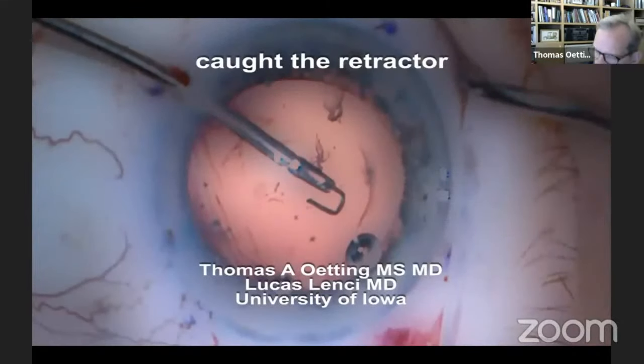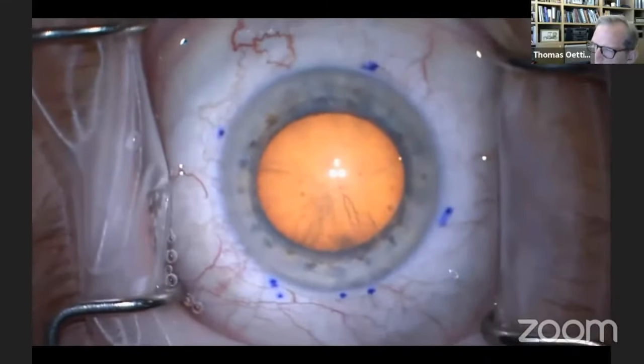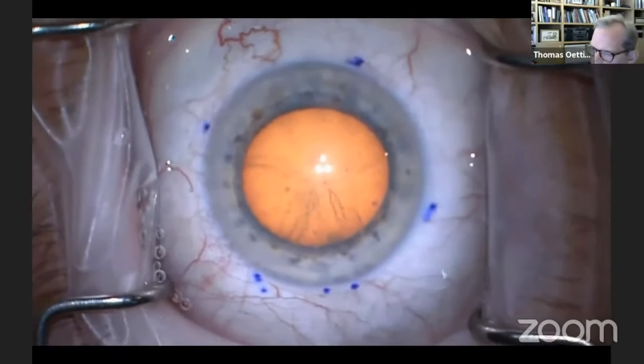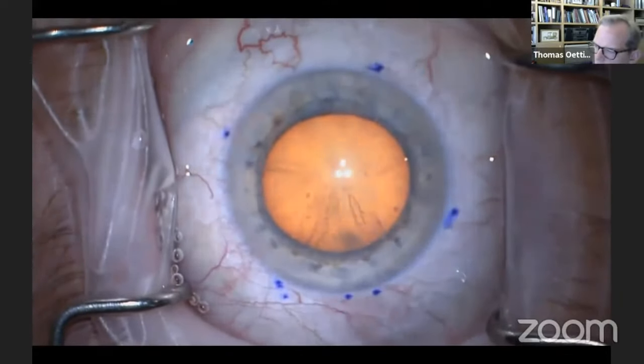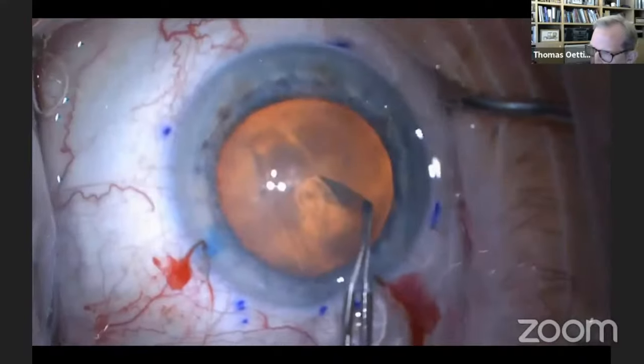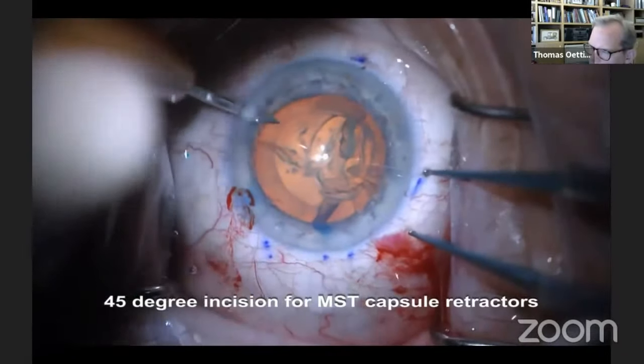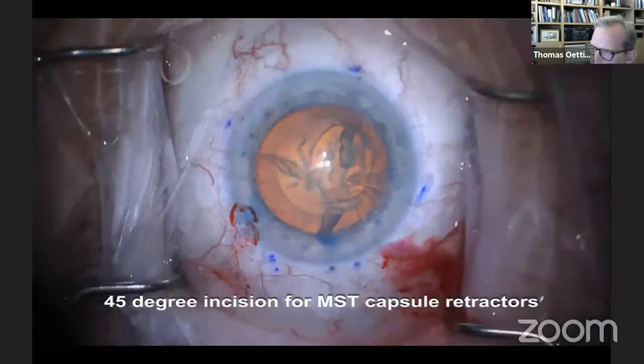So here's the example I was just talking about, which is analogous to that kid getting his head caught. And I wanted to go through the use of MST capsule retractors, which I really love. These are capsule retractors which are useful for loose zonules. Here you can see the rhexis is perfect. This is one of our residents who did this surgery. It was a beautiful job. We're placing these MST retractors.